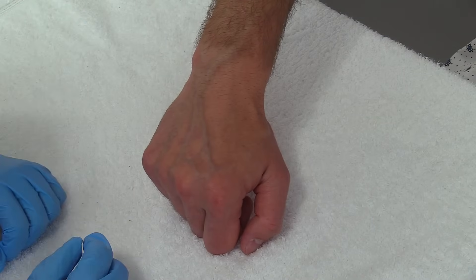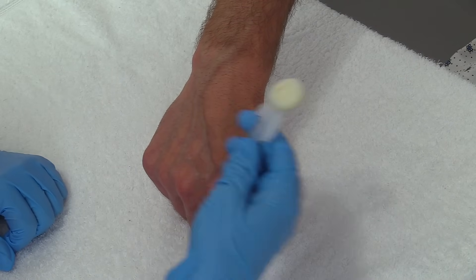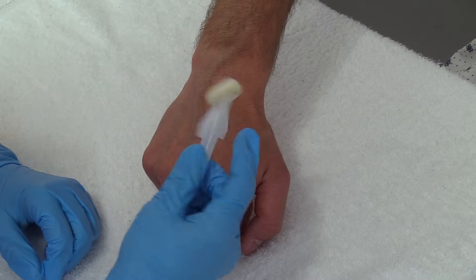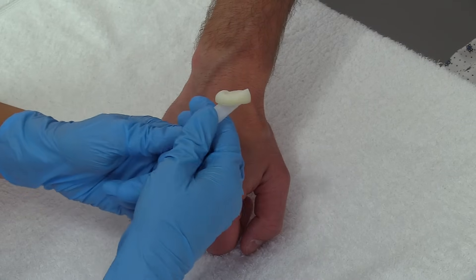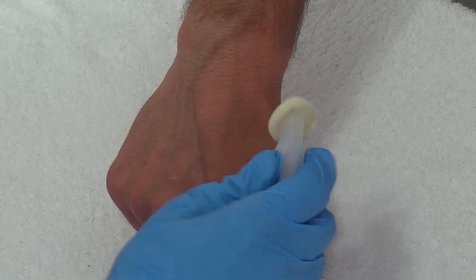Before we even stick the vein we first have to disinfect the site, and we're going to use the chloroprep that comes with the kit. Depending on what type of kit you have will depend on what it looks like. With this particular one we're going to take this and just push it together — you hear that cracking noise, that's just releasing all the chloroprep.